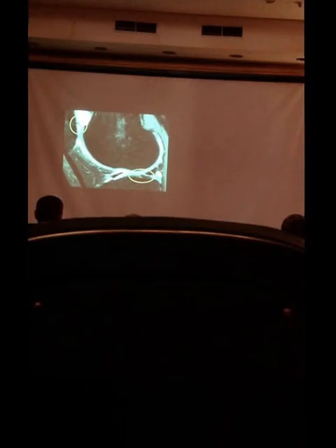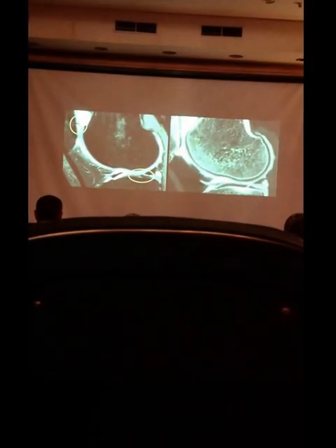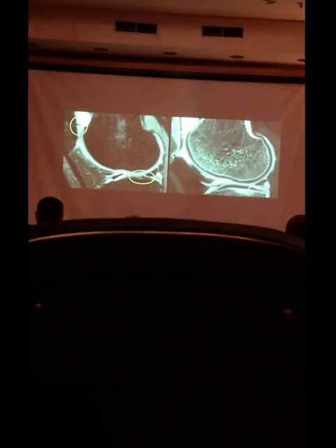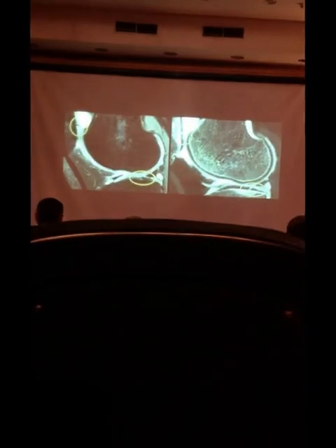This is more diffuse, and this is more linear in the patella. No subchondral bone marrow changes whatsoever. Maybe a small one here in the patella. And we have correlation with CT arthrography, and you see that we have a deep fissure of cartilage here, and another deep fissuring of cartilage here. So this was pathology. This is very tricky, and very hard to call when we're reporting those.